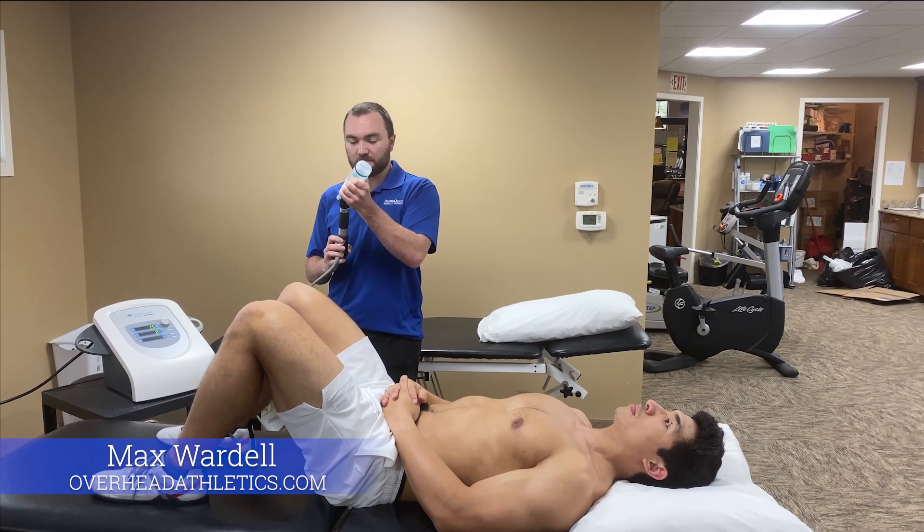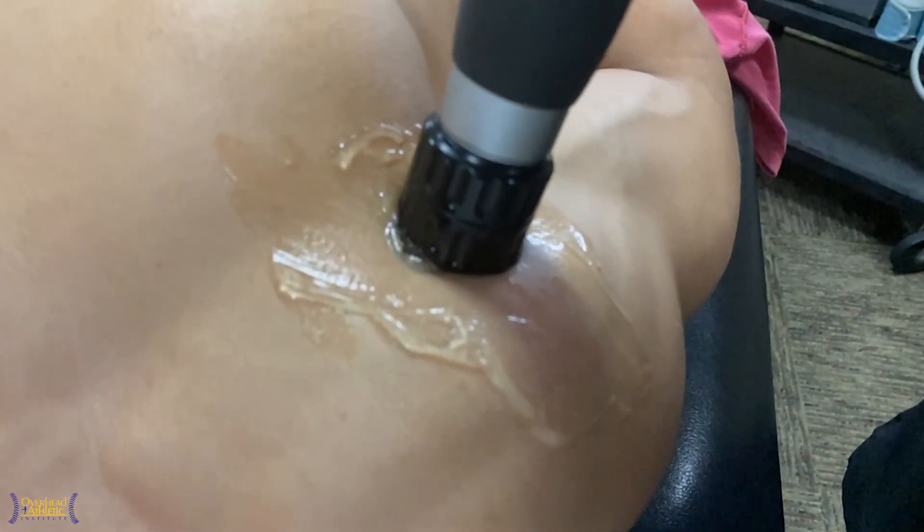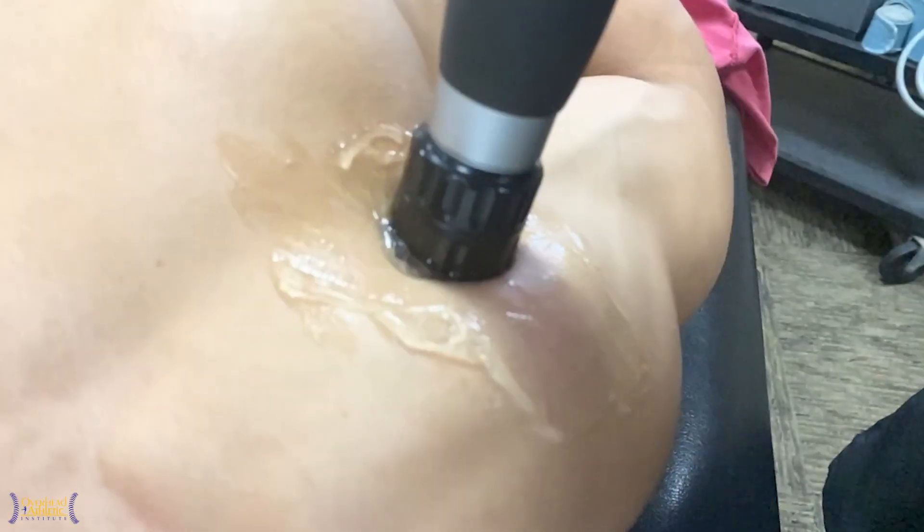Hey guys, welcome back to Overhead Athletics. Max Wardell here at HealthQuest Oxford. Today we're going to do some shockwave therapy on the anterior shoulder.